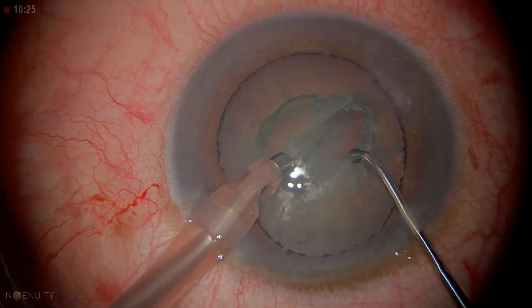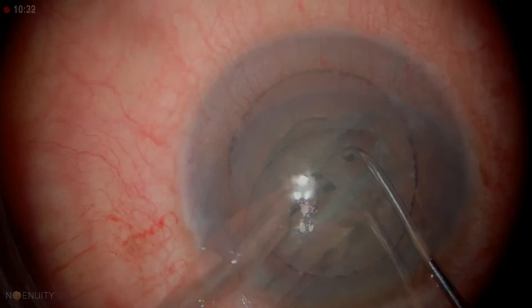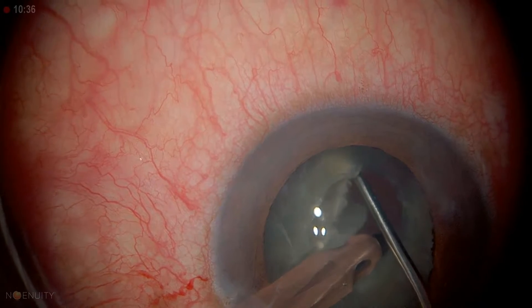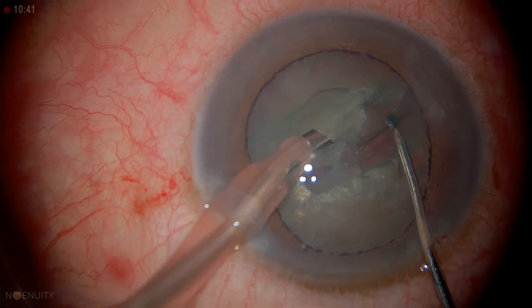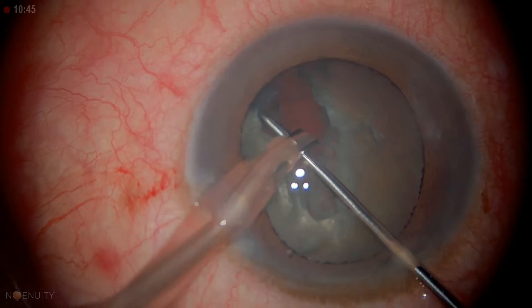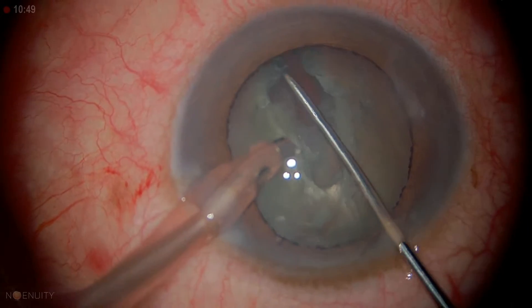Now you can crack this, or try to. We're going to try to crack — which it did. Now we're going to do our stop-and-chop. We can turn this, then go to the chop setting.